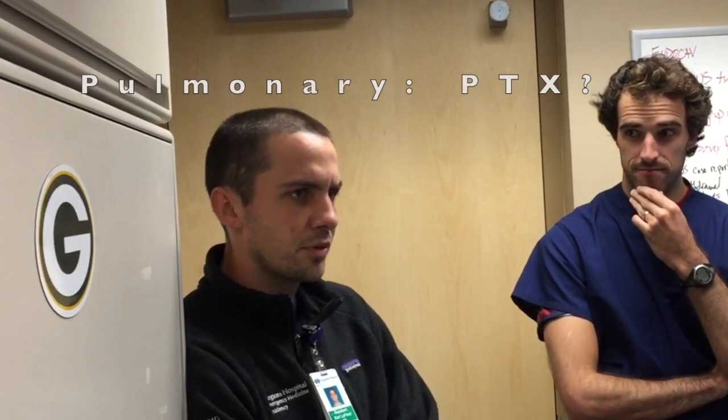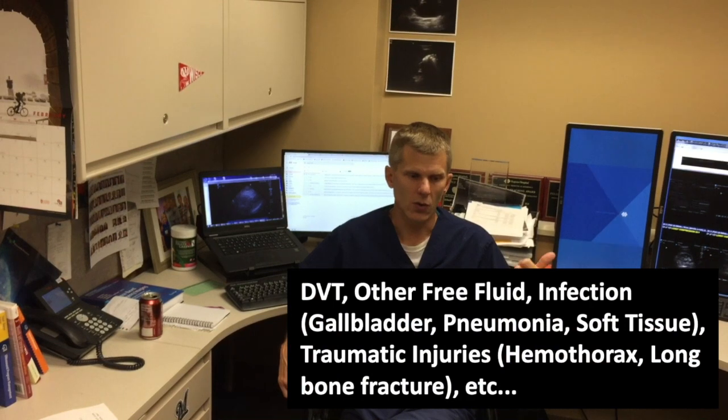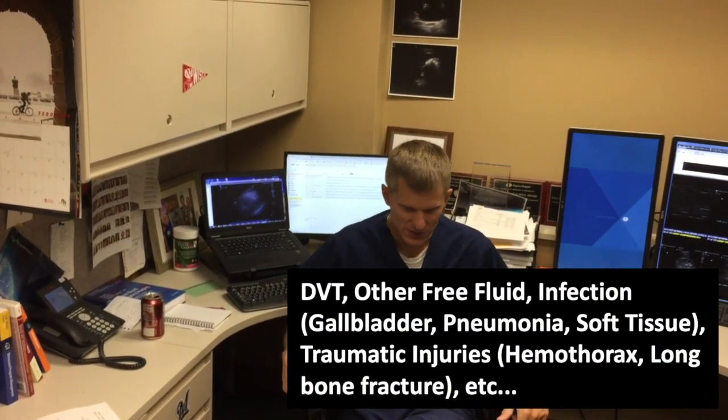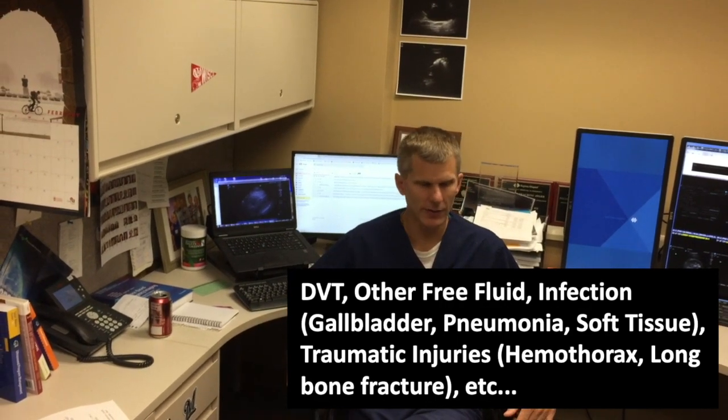For pulmonary, mostly pneumothorax. But you don't have to stop there — you can look for other things like a DVT, other free fluid on the FAST exam, other infectious causes, or take a look at the gallbladder. There's a whole lot of other value too.